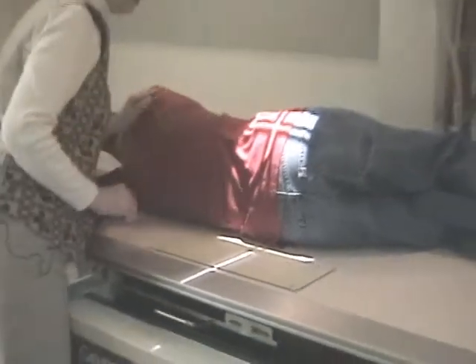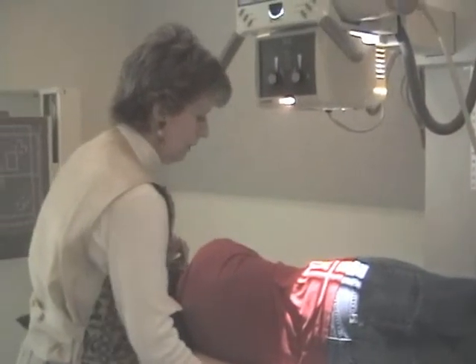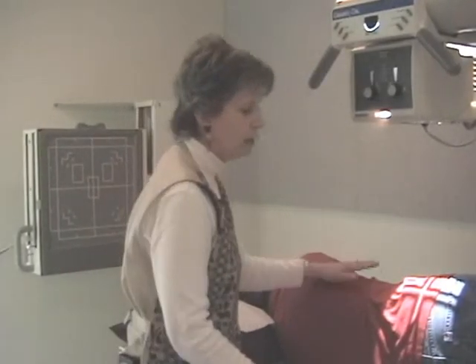Again, I'm centered to the film, so I can push this in, and the patient didn't move. They're still in a true lateral position. They're comfortable with the sponge between their knee, and I may make my exposure. Remember, your left marker is on the anterior wall. And I'm going to have my patient lay there for a minute because I'll do a little bit of film critiquing here.